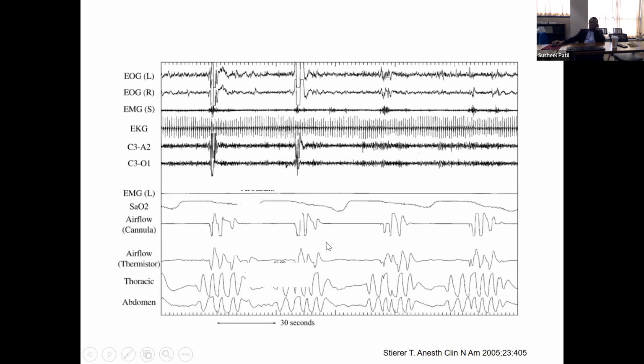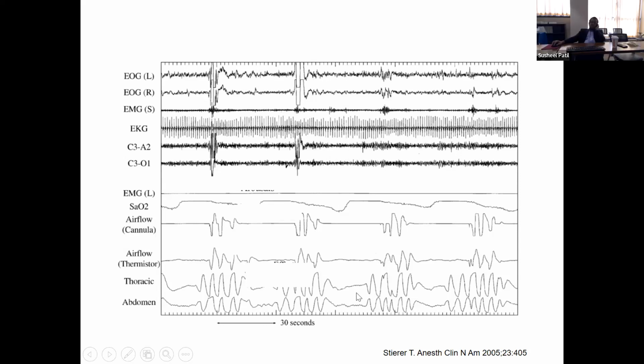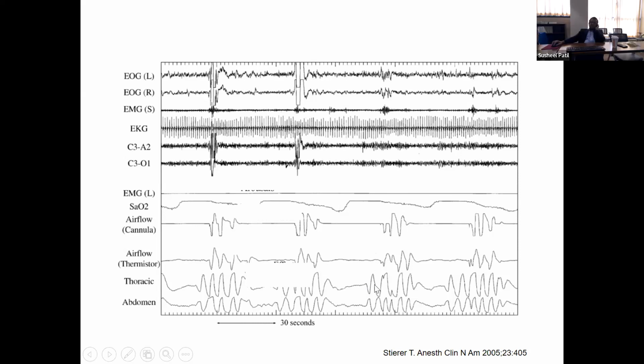Apnea or hypopnea? I'll call this definitely an apnea event because of the flow limitation; the reduced flow of the thermistor is less than 10%. Okay, and is it obstructive, central, or mixed? I'll probably call it obstructive. Okay, because you see effort. Yes. What about this part of it?